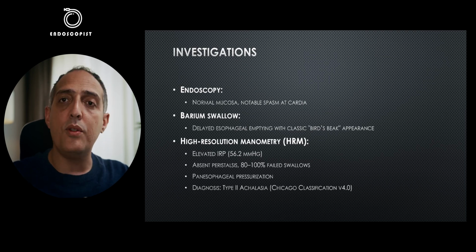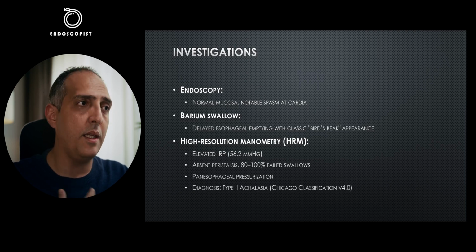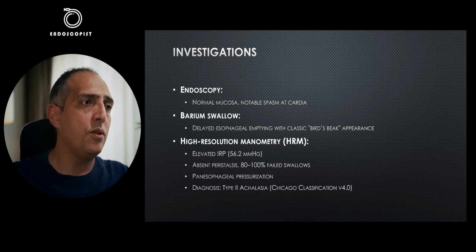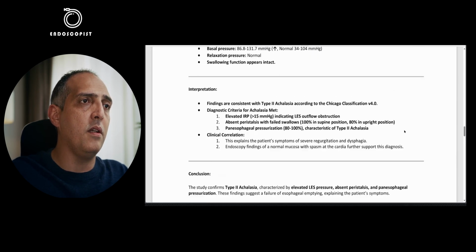Investigations done, endoscopy showed normal mucosa with some spasm at the level of the cardia. Barium swallow showed delayed esophageal emptying with classic bird's beak appearance. High resolution manometry showed elevated IRP, absence of peristalsis, panesophageal pressurization, and the diagnosis was type 2 achalasia. Here we can see the images of the manometry.